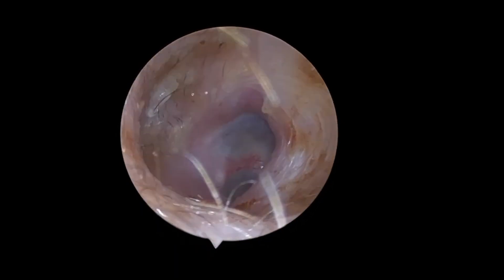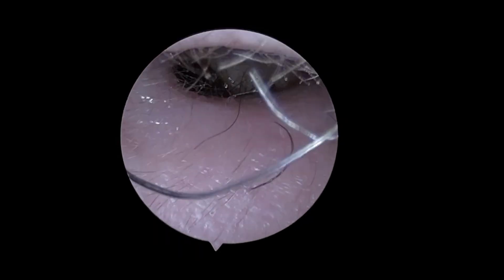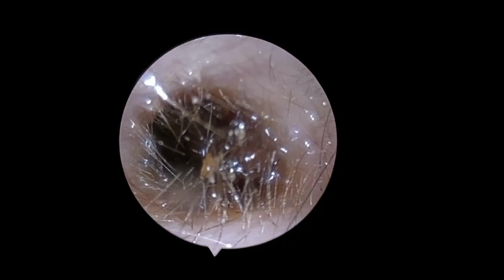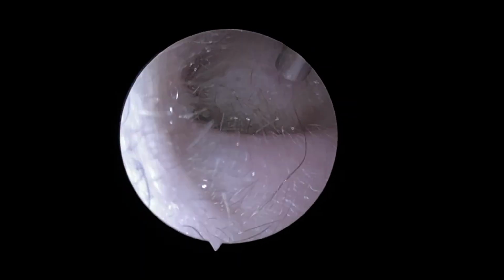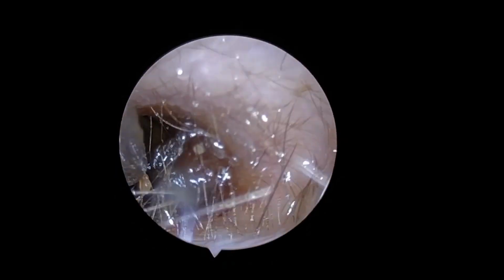Now over to the left side. As I go in, you can see there is a red area just on the flap of the skin called the tragus. I've asked King Baratheon to keep an eye on this and see the GP if it gets any worse or it doesn't go away. It certainly wasn't there at his last procedure and looks like a bruise to the skin of some sort.